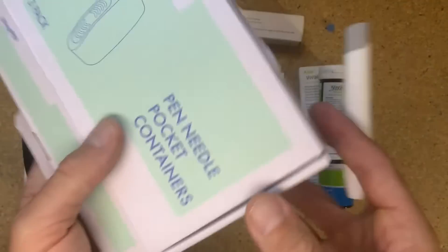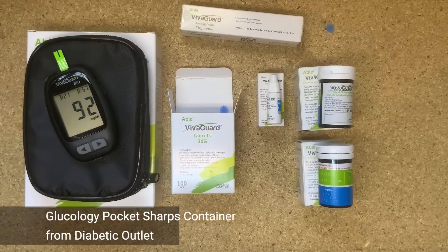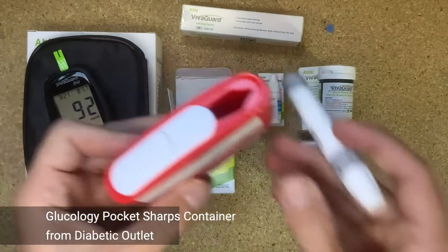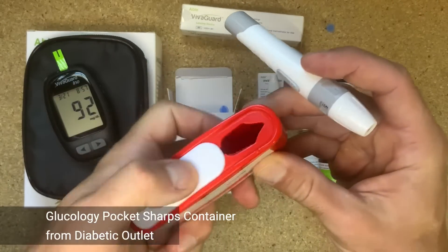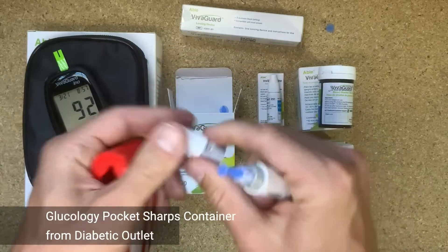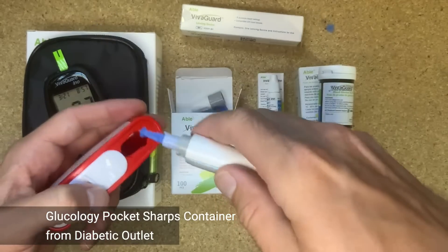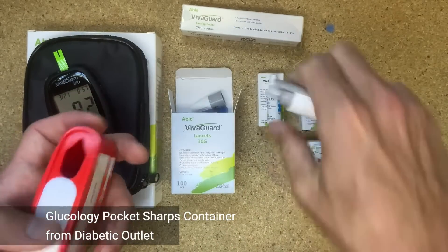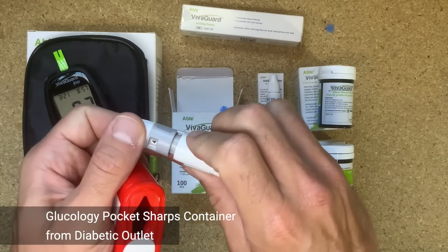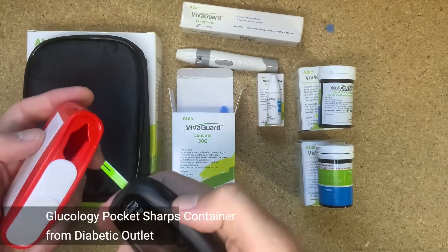So I'll bring in another product that we have at Diabetic Outlet, which is a pocket container for pen needles. Three in a box — take one out — and you can see it just allows you to seal up and not have to carry your sharps with you. So I'm going to remove the top and find the eject tab here, and eject it into the pocket container. And I can actually do the same thing with my test strip.